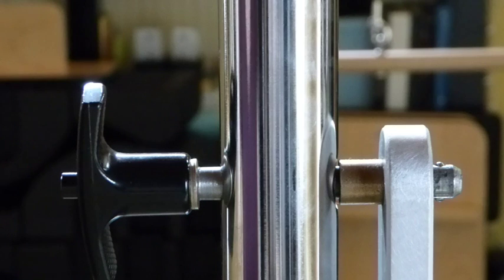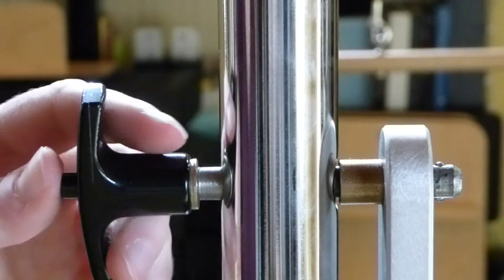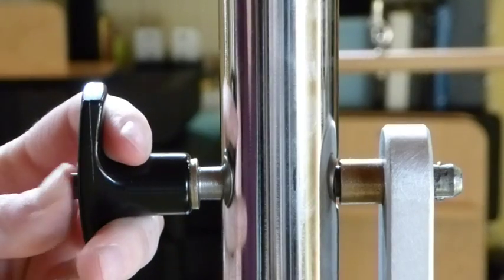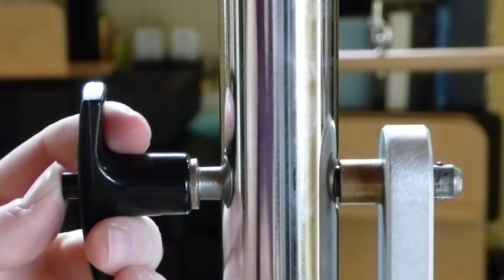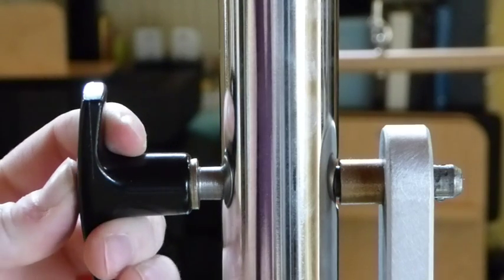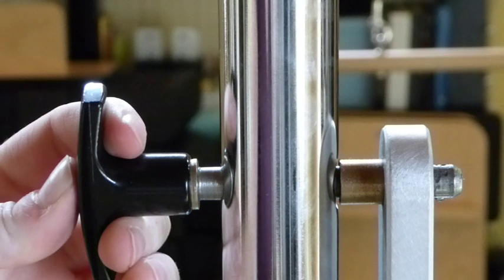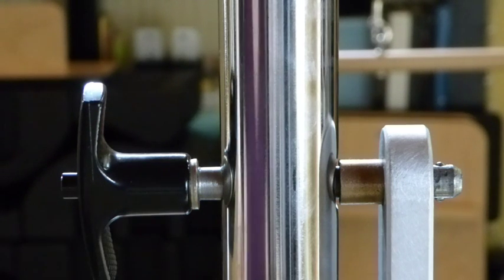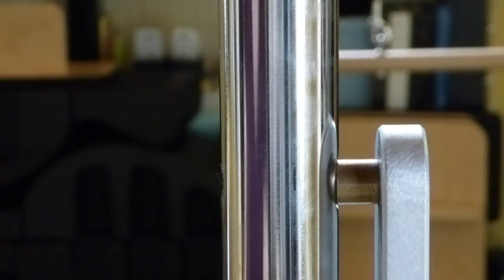The next thing we want to check are your T-pins for your push-through bar. If you have the kind that has the button, you want to make sure that when you press the button, this ball depresses. You can see that it goes up and down. If that ball is stuck in the down position, even when you let off of the button, you need to replace that T-pin right away. Because if the ball is depressed, then your T-pin can come right out at any time, and you don't want that.